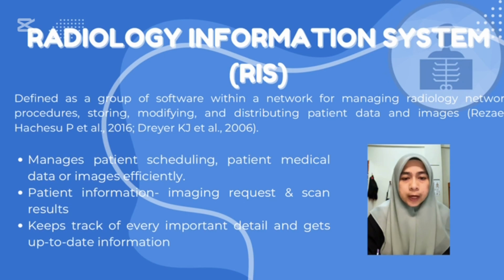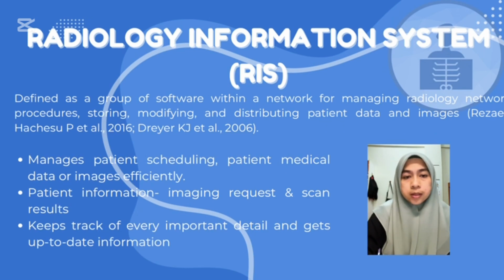For example, after the images are taken, radiologists will analyze the images and create a report. This system will help store and organize this report so doctors can access it whenever or wherever they want. It also keeps track of every important detail and gets up-to-date information.